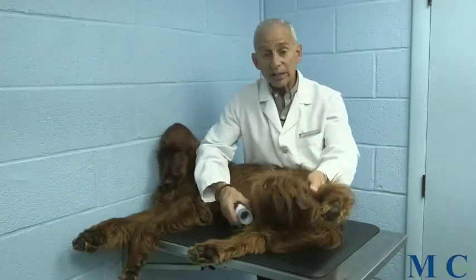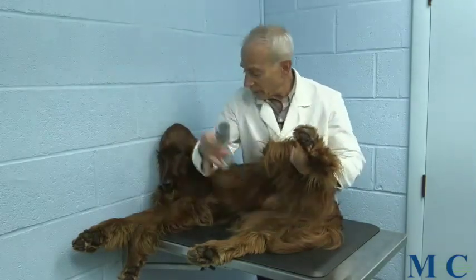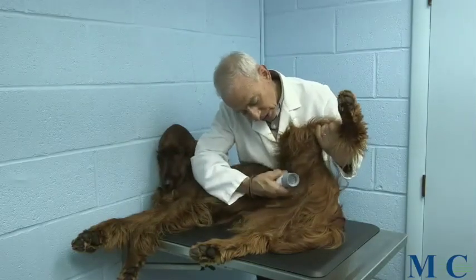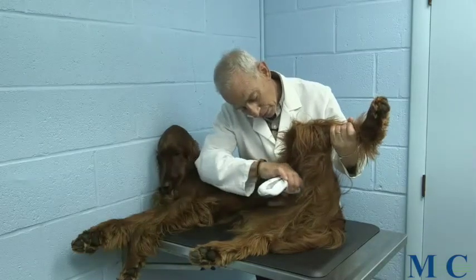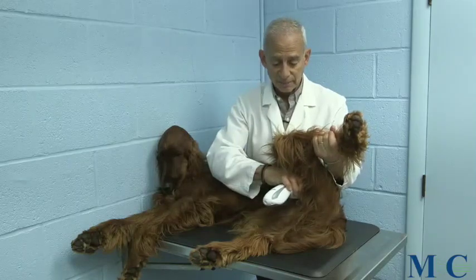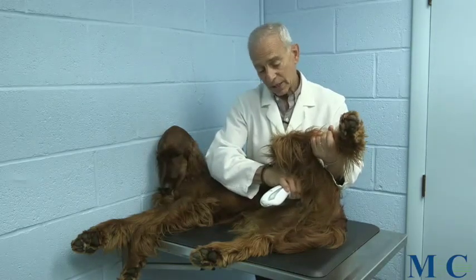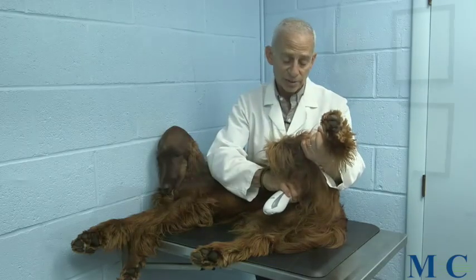When you're going to treat lymph nodes, I always call it the armpit of the back leg. If you can get your pet to lay in this way, that's great. What you want to try to do is just go right underneath there — what I call the armpit — and place it so it makes as flat contact as possible to the skin. It's very important. If it's angled this way or that way, you're not getting the full benefit of the light penetrating through the skin.